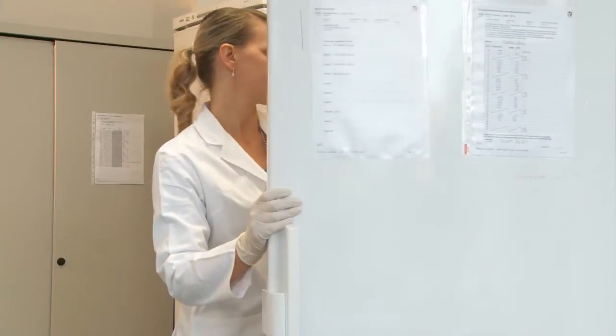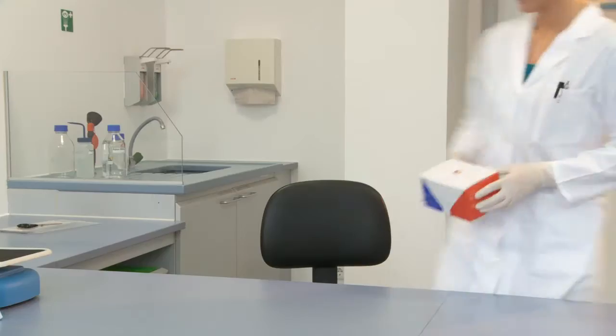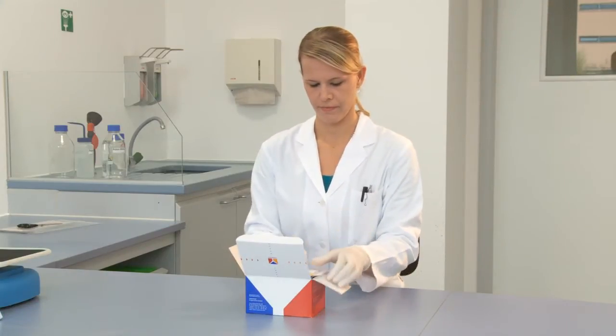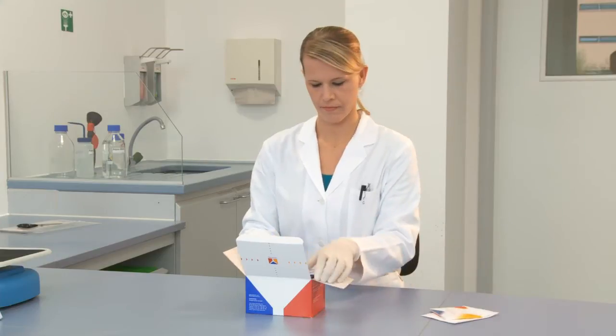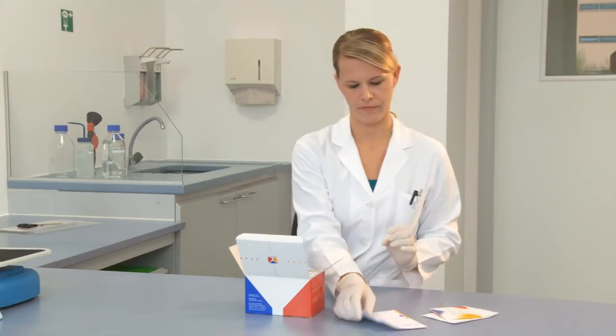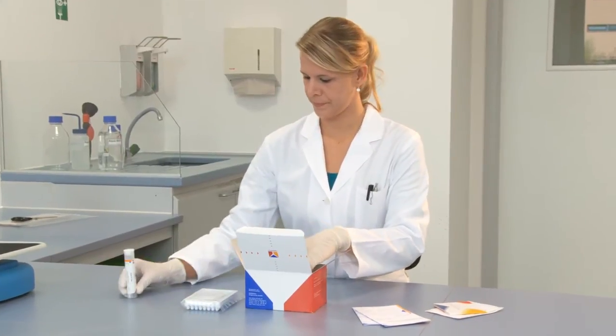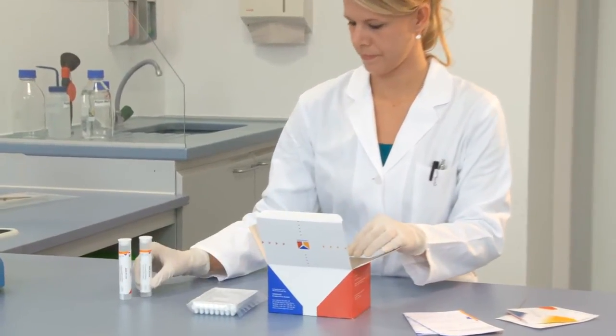Various manufacturers offer kits that contain all the reagents and materials required to carry out the immunoblot test. These include a plastic tray with several compartments in which the blot strips can be individually incubated, prepared test strips, and a calibration strip.